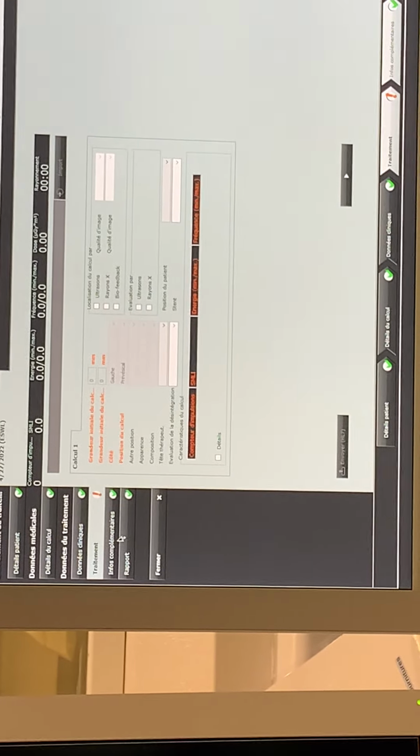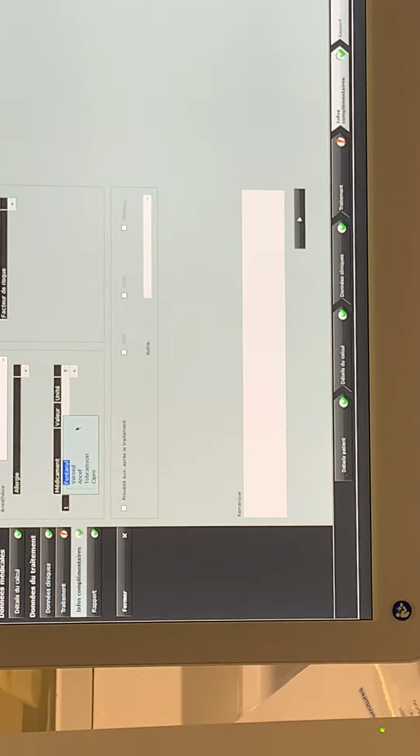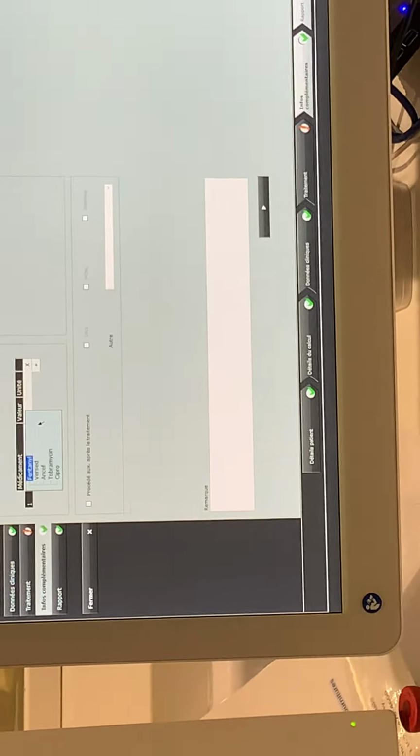If we go to the next chart, you can enter the medicaments, for example, the medicine. We entered already some medications. You can choose from them, or you can also enter your own. It's mostly fentanyl and Versed in our case. That's what we do here. So Dr. Lieberman entered these data all of the time.